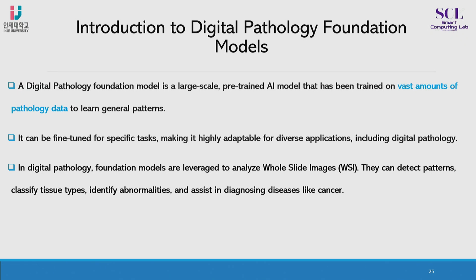So a digital pathology foundation model is a large-scale pre-trained AI model that has been trained on a vast amount of pathology data. This is very important because developing a domain-specific foundation model is very important. Nowadays, if I read some papers, mostly people are going towards developing, for example, CT scan based foundation models, X-ray image based foundation models. In our case, it is a digital pathology based foundation model, domain specific.